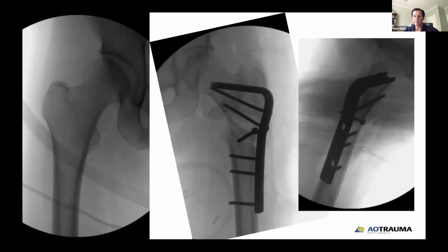So now I have two surfaces that I can't stably compress because I'm really riding on a very small knife edge of anterior bone and I've got a posterior defect. And rather than shorten the patient more to achieve better surfaces to compress, I thought she was young. I could stabilize the osteotomy. I placed a neutralization screw across it and used my wedge to bone graft the posterior gap.